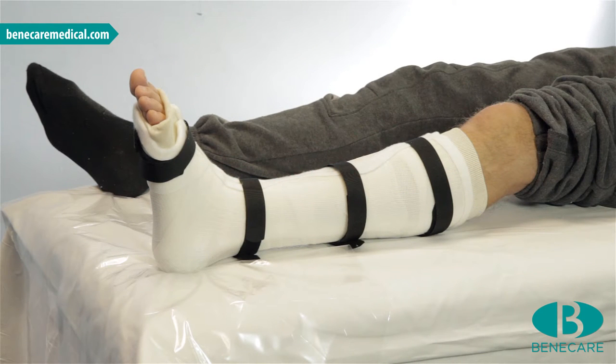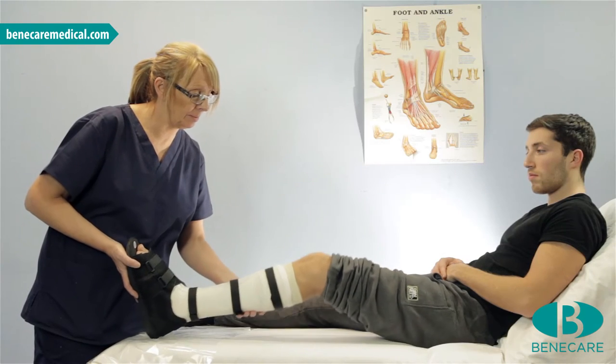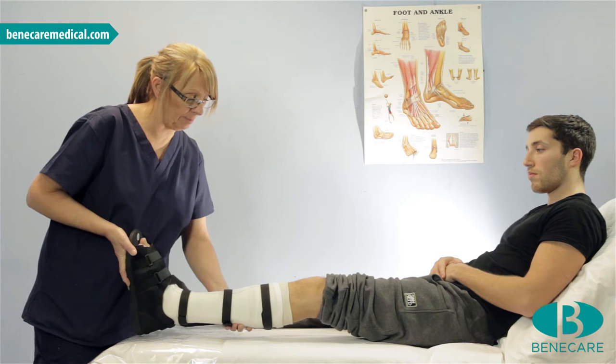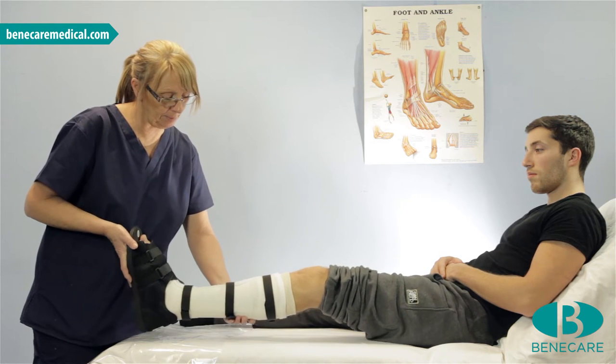Today, I'm applying a below-knee FRC cast. FRC means Focus Rigidity Cast. This type of cast is suitable for all indications in and around the ankle. This would include fractures, trauma, orthopaedic conditions and soft tissue injuries.